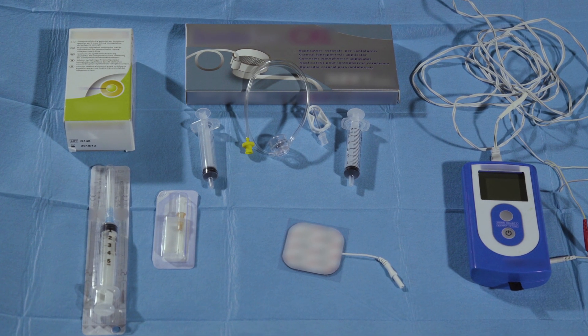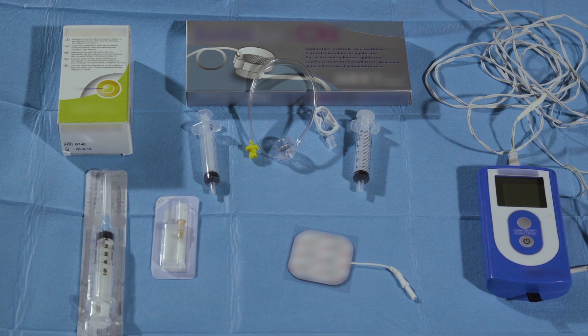I am Cosimo Mazzotta from the Siena International Cross-linking Center. We are showing now the new enhanced fluence pulsed light iontophoresis protocol for trans-epithelial cross-linking.